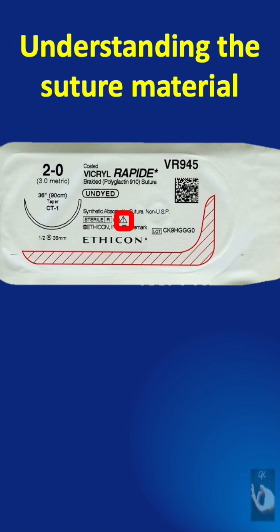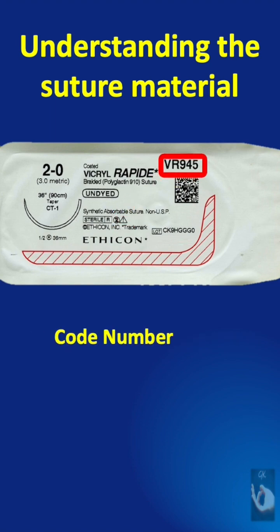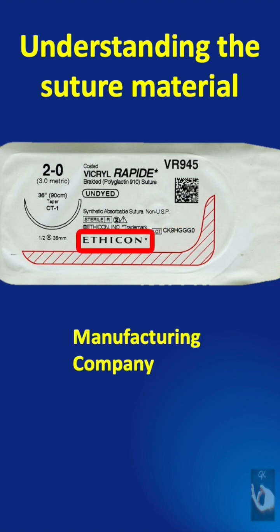It is not to be reused and we need to see instructions before use. This is the code number of this suture material and the QR code for instructions. This is the batch number to be used if any complaints are there, and this is the manufacturer's name.